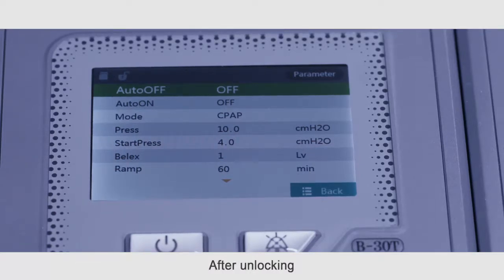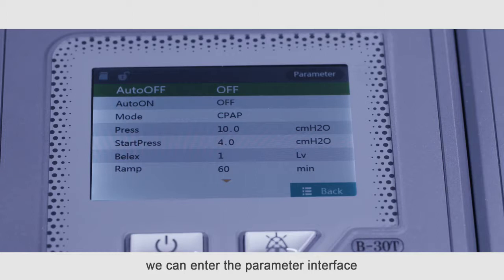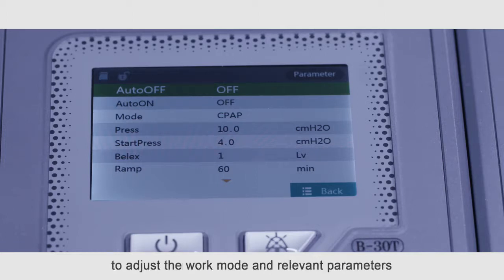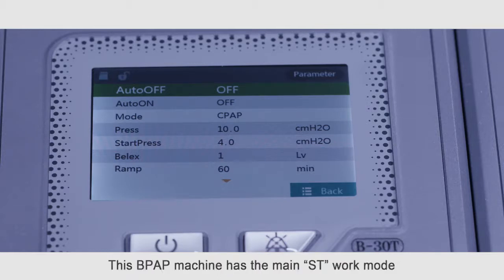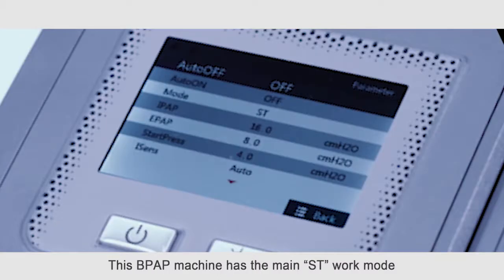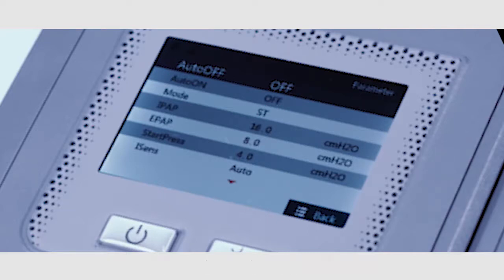After unlocking, we can enter the parameter interface to adjust the work mode and relevant parameters according to doctor's order. This BPAP machine has the main ST work mode.